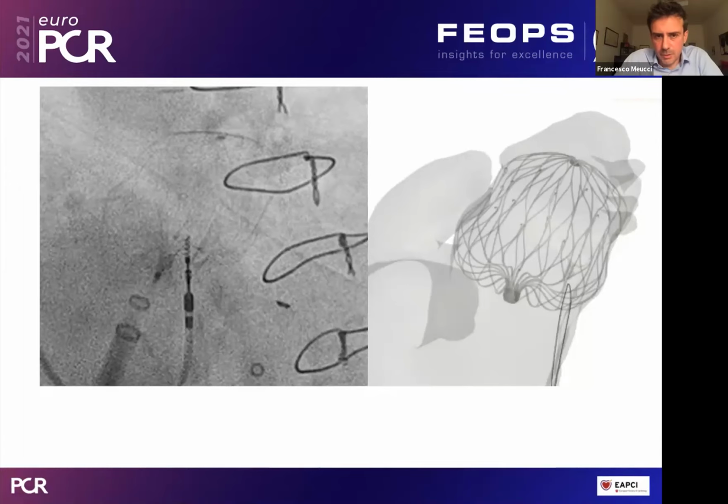I think one of the most important insights is when you have to face a big appendage and you can have problems with surrounding structures. So the simulation of where you will land and what you can do to the surrounding structures, most of all the mitral valve, is paramount. Then there are also tricky appendages like the one with a chicken wing morphology, where you can play very much before going into the cath lab and choose the position and the right device.